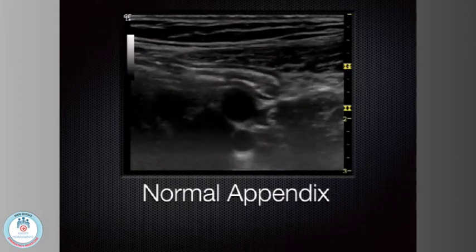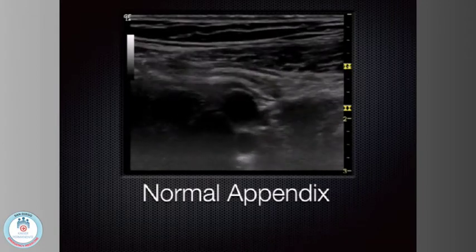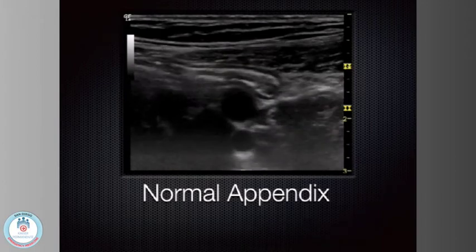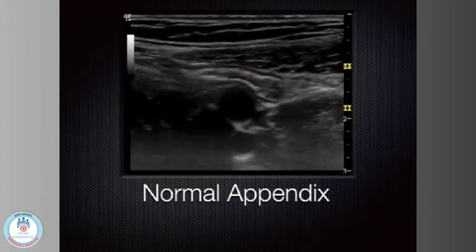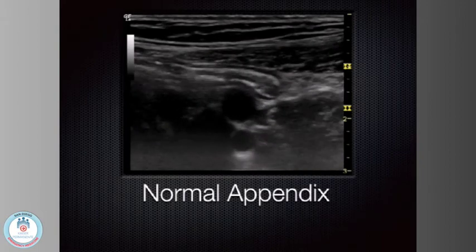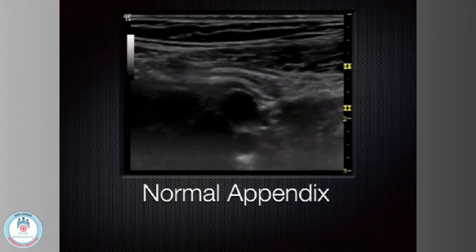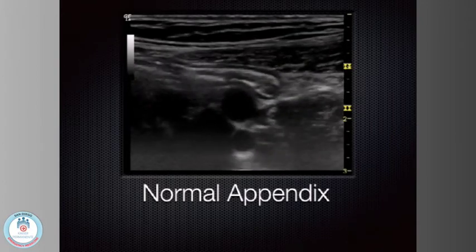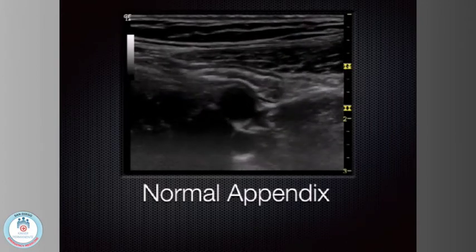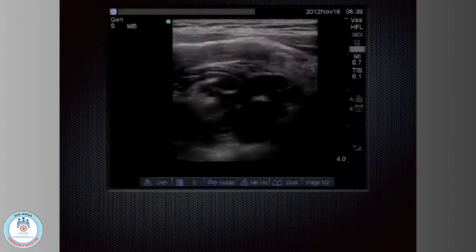When you have bowel pathology, it suddenly becomes much easier to see. Same thing with small bowel obstruction, same thing with diverticulitis. On ultrasound, those things are hard to see. It's hard to see normal bowel in ultrasound because it's all filled with air. But when you have a portion that's filled with fluid, that's all distended, that's aperistaltic, and the patient points to where the pain is, and you go to compress and it doesn't compress, and there's a fecalith, there's a nice shadow there at the entrance of the appendix, then I think it's a lot easier to see these things.